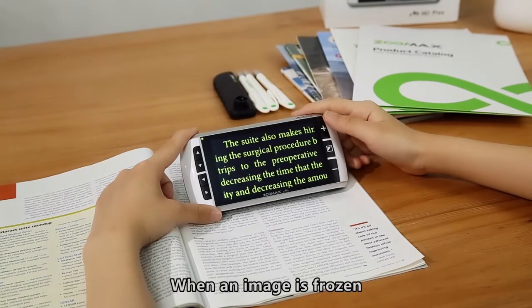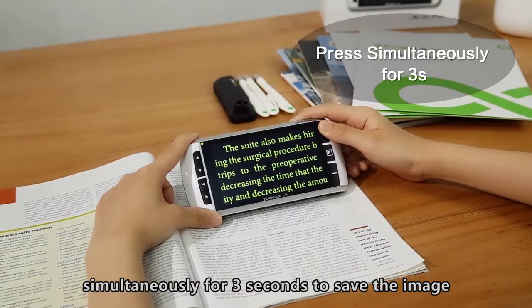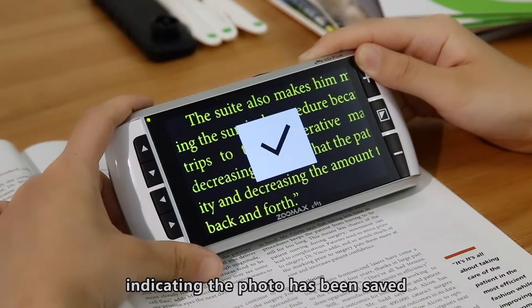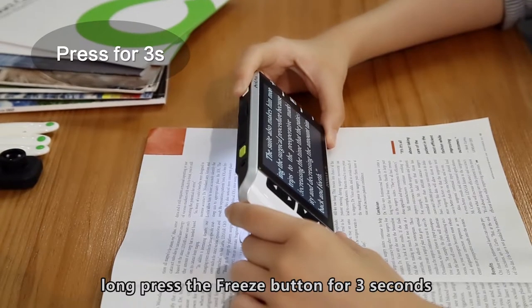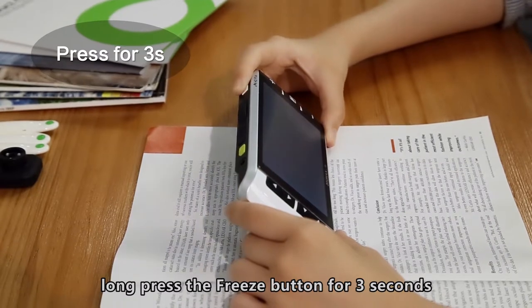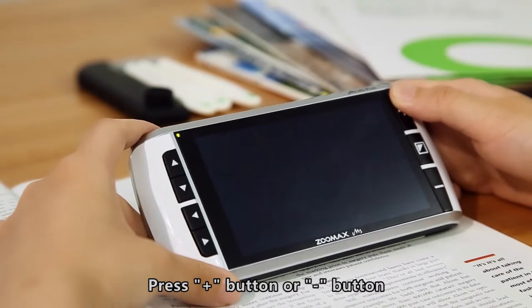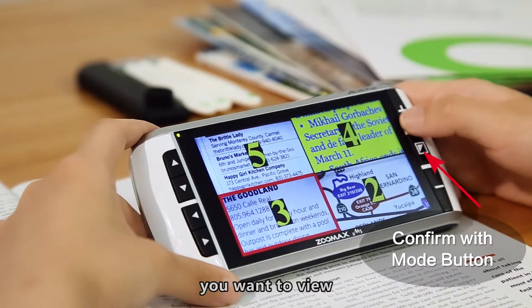When an image is frozen, press the Freeze button and Zoom In button simultaneously for 3 seconds to save the image. A tick icon will appear on the screen indicating the photo has been saved. To browse saved photos, long-press the Freeze button for 3 seconds and the photo index display will appear. Press the Zoom In or Zoom Out button to browse through your photos and press the Mode button to confirm the photo you want to view.